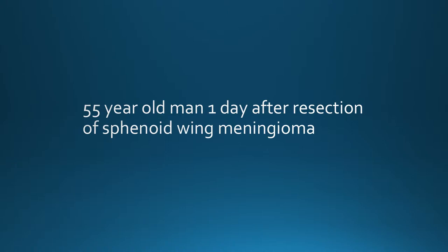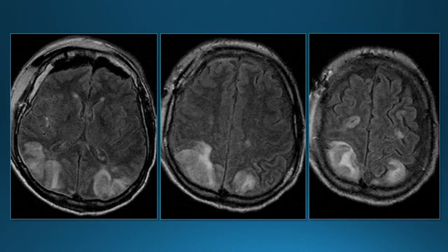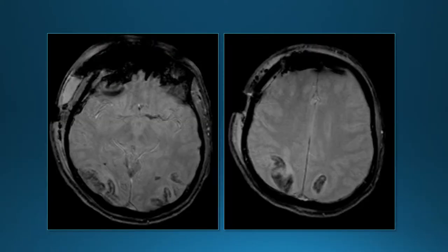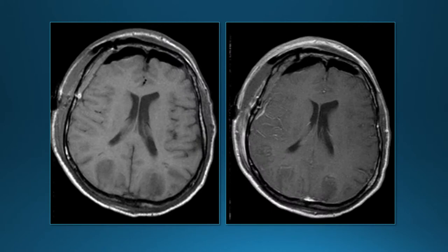Next case: 55-year-old man, one day after resection of a sphenoid wing meningioma. FLAIR images show symmetric areas of abnormality involving the gray matter and subcortical white matter bilaterally. Gradient echo images show bilateral hemorrhage, with the hemorrhage mostly involving the cortex. Pre- and post-contrast images show no enhancement.